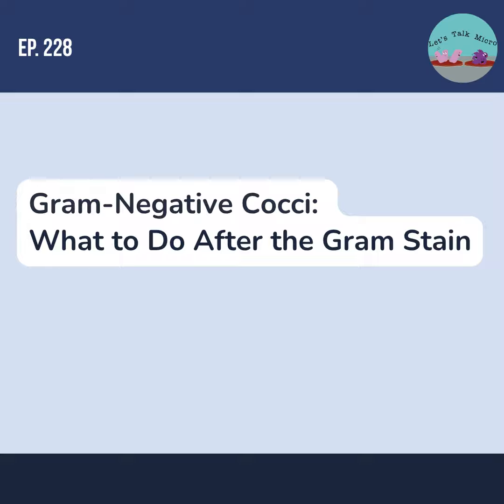I keep mentioning it, so let's go ahead and talk about it. So this is an enriched and selective medium for the isolation of Neisseria gonorrhoeae and Neisseria meningitidis. The enrichment portion is chocolate agar, and the selective portion is antibiotics. So it has colistin, which inhibits most gram-negative bacteria, vancomycin, which inhibits gram-positive bacteria. It has nystatin, which inhibits yeast, and it has trimethoprim, which inhibits the swarming of Proteus.